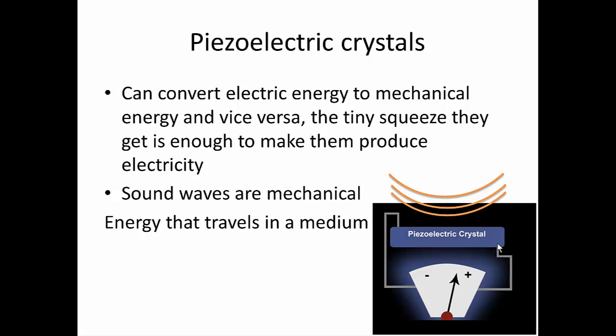So these are called direct and indirect piezoelectric effects. So indirect is if we apply electricity to the crystal, which will then make it shrink and expand, and every time we do that, we emit a sound wave. And the direct piezoelectric effect, of course, is receiving sound waves and converting these into electricity. And whenever that happens, we can use a computer to integrate this and generate an image out of the received signal.